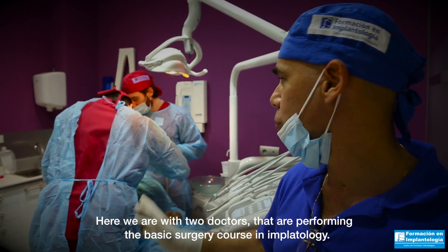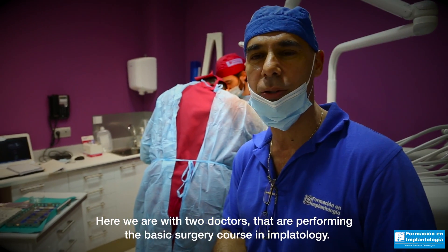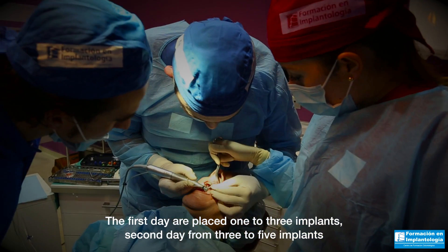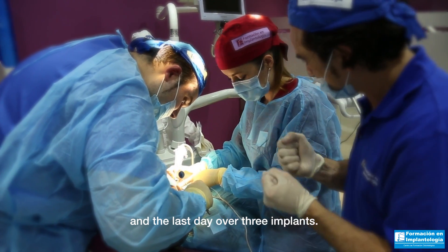Here we are with two doctors performing the basic surgery course in implantology. The first day, one to three implants are placed; the second day, three to five implants; and the last day, over three implants.